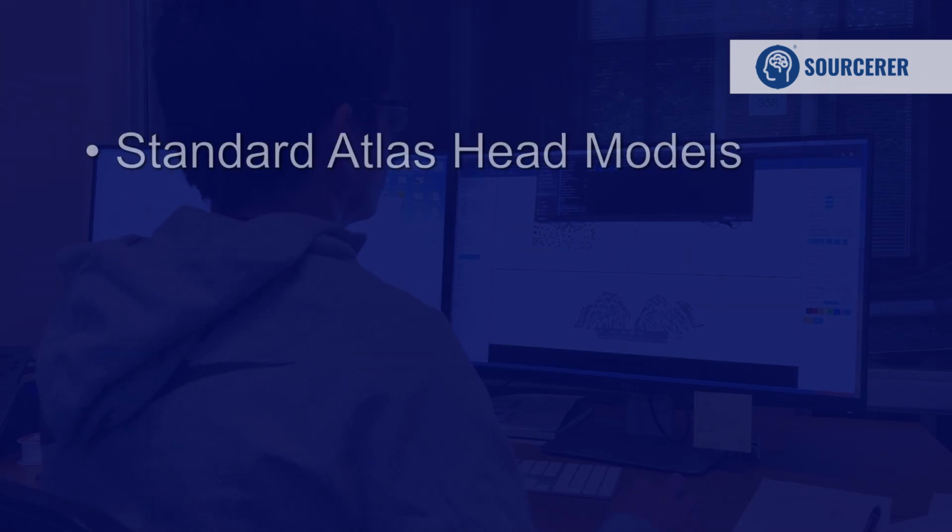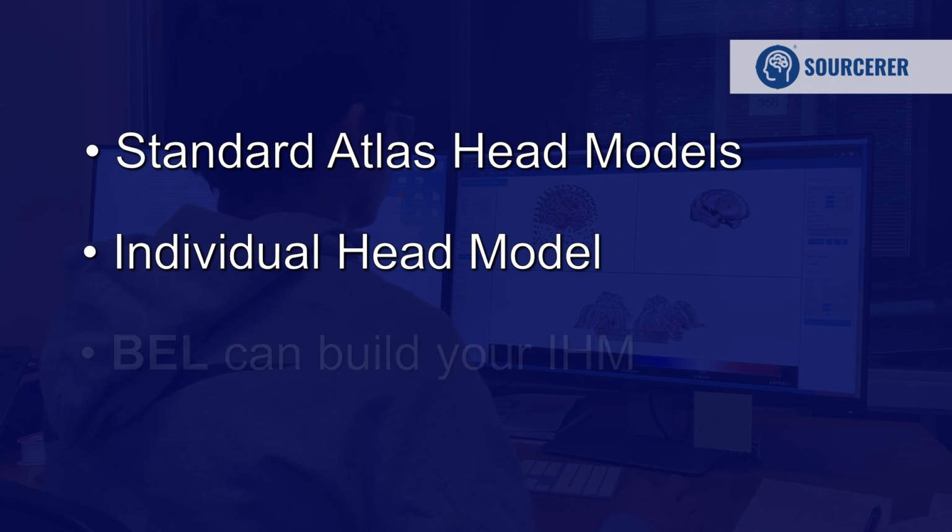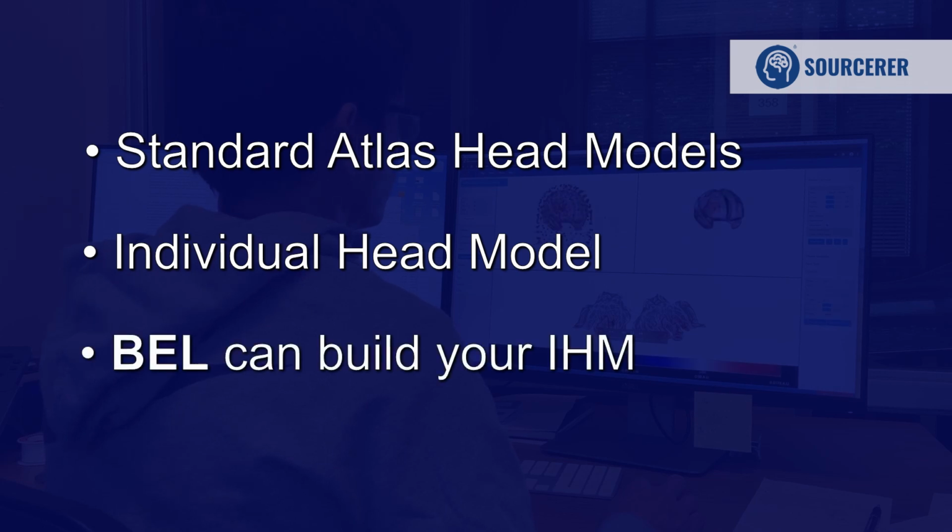Users can choose from included standard Atlas head models with no MRI data required, building their own individual head model if MRI data is available, or having BEL build them an individual head model with their EEG and MRI data.